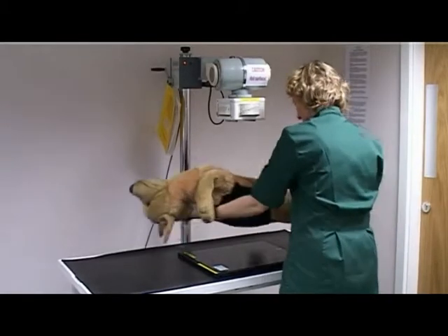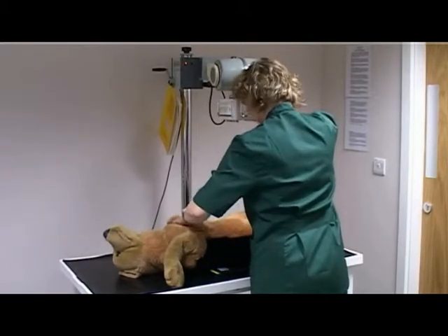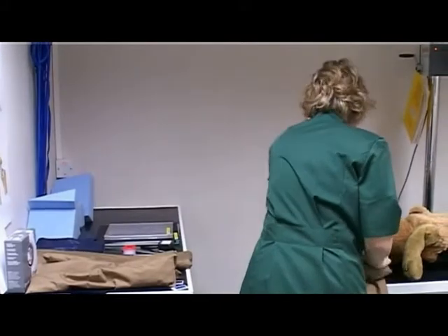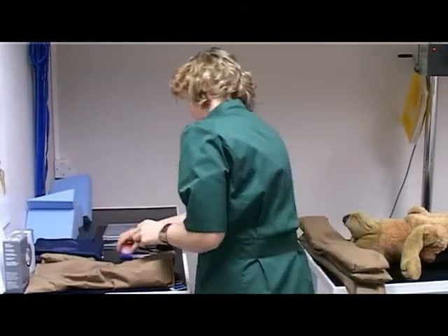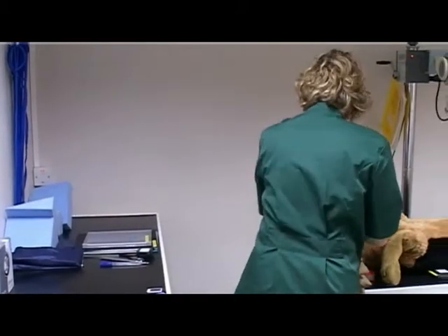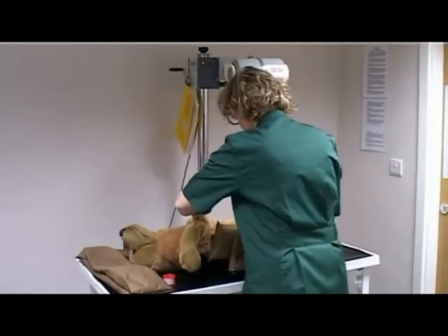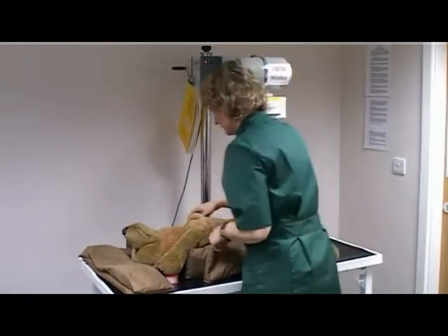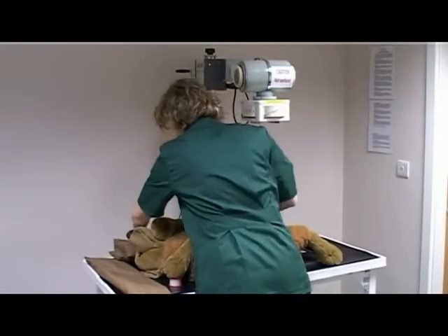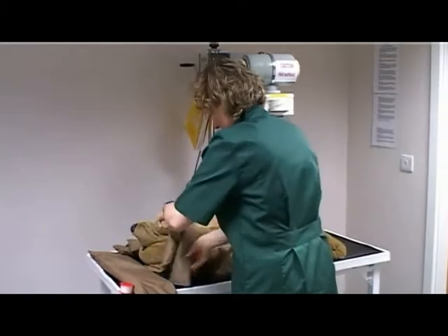Place the patient in dorsal recumbency with the pelvis positioned on the cassette. Select the positioning equipment; use a trough or sandbags to prevent rotation of the body. Draw the forelimbs cranially and place one sandbag over each forelimb or use ties.